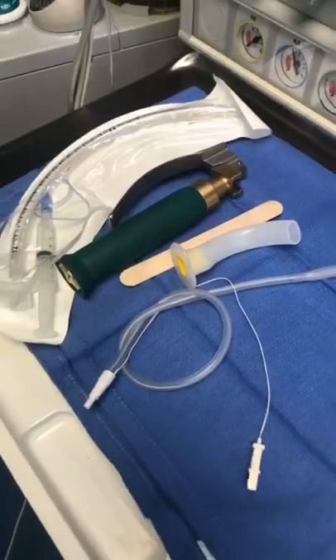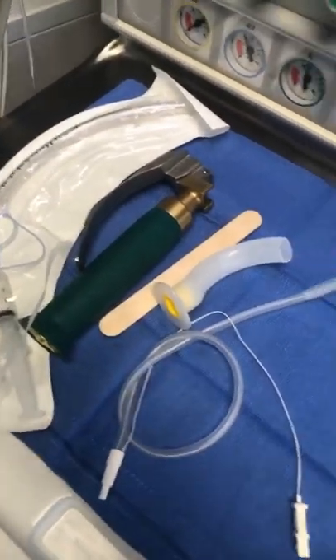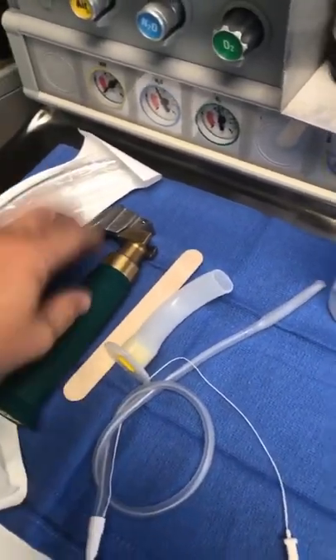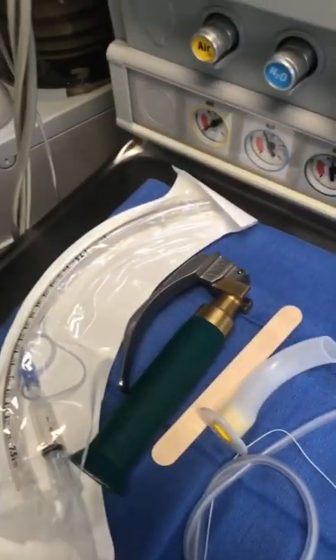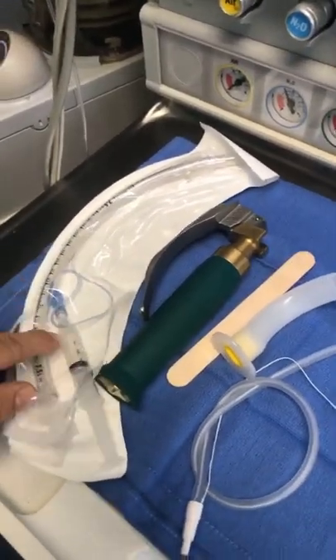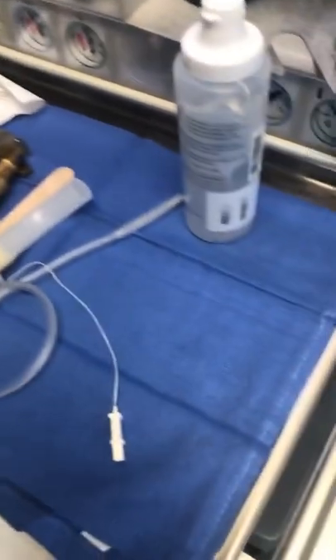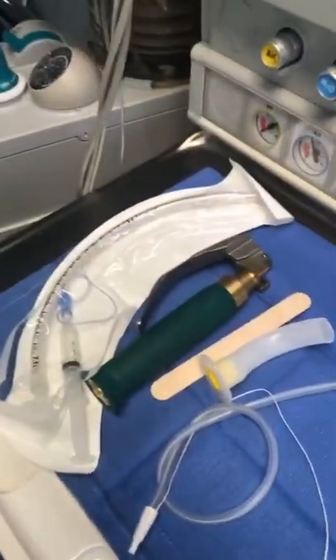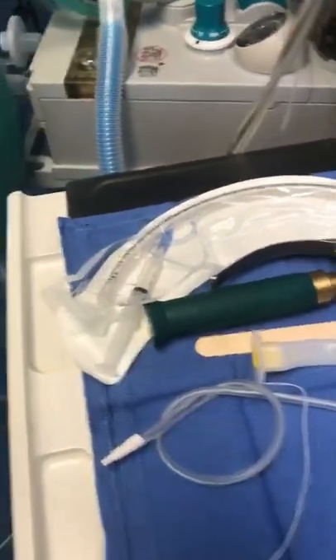You've seen this before — the top of my airway cart. I've got an oropharyngeal airway, tongue blade, MAC blade and handle based on appropriate patient size and selection, endotracheal tube, pilot balloon, and some lubricant. Nothing really special there, and we're ready to go.